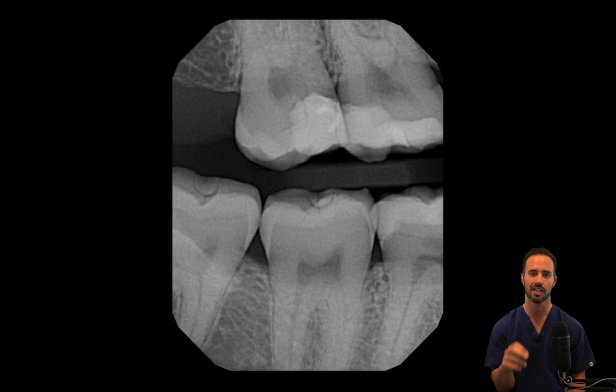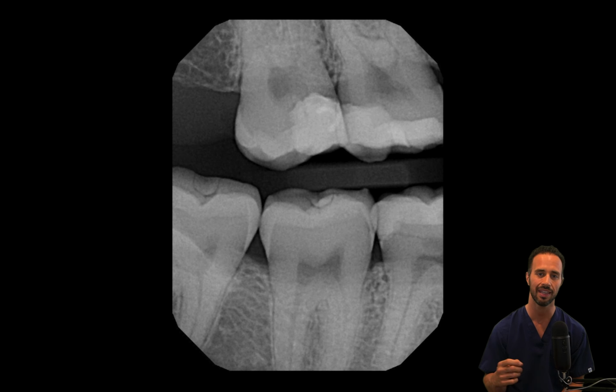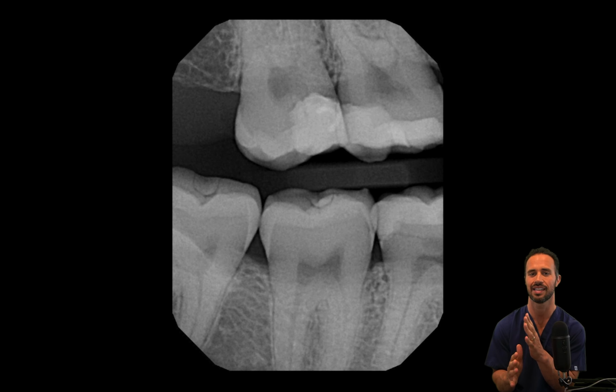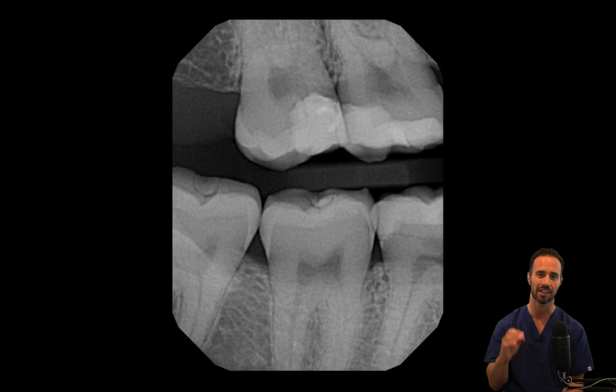All right, I'm going to discuss with you how I go about discovering whether or not an MB2 is present. In this case, there isn't, but I'm going to show you exactly how to do it so that in our next case, where there actually is an MB2, it's the same process and you'll find exactly how to discover it. So without further ado, let's get right into it.